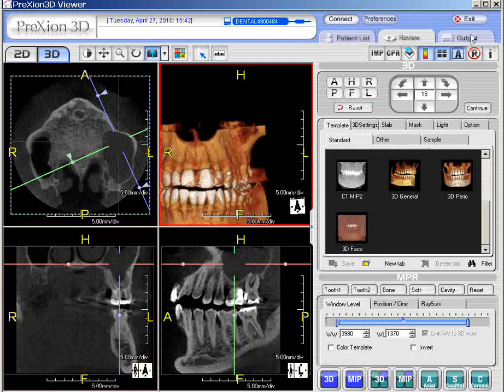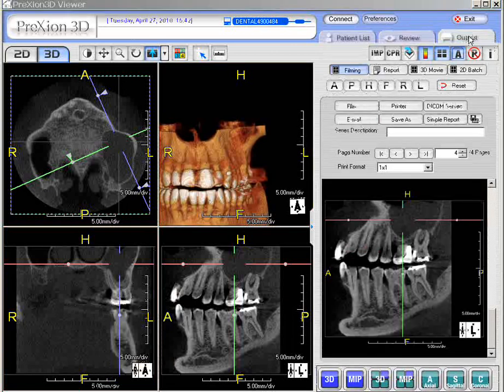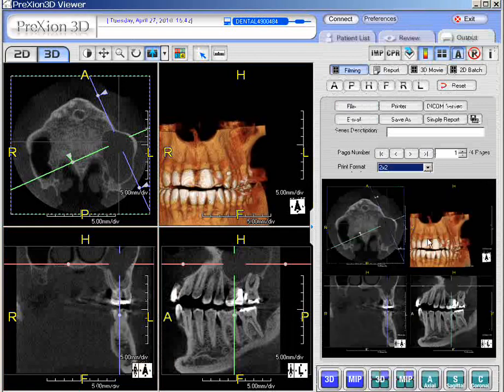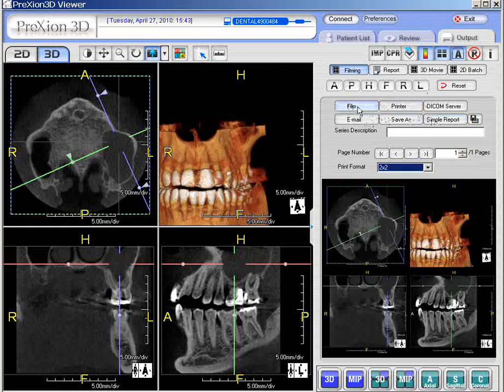Go again to the Output Panel. Let's change the format — you've got four images, so you can set print format to two-by-two or four. You can print, save as, simple report, email, or film. Film is basically for a thermal printer, mostly for hospital-grade or large clinics — you probably won't need that. You'll be using a printer.